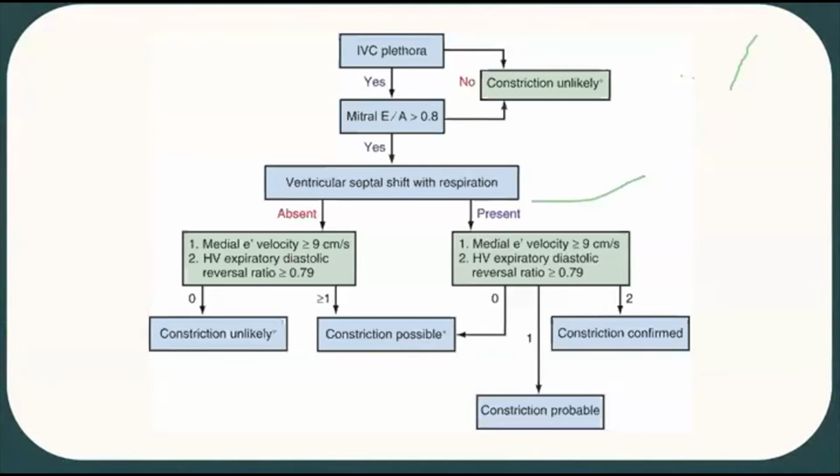This diagram essentially just shows what the Mayo Clinic published as the echocardiographic signs or criteria of constrictive pericarditis. And I think with this, you can come to a reasonable conclusion based on just echo alone, whether or not you have constriction.